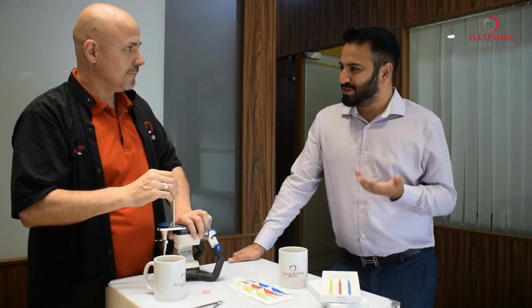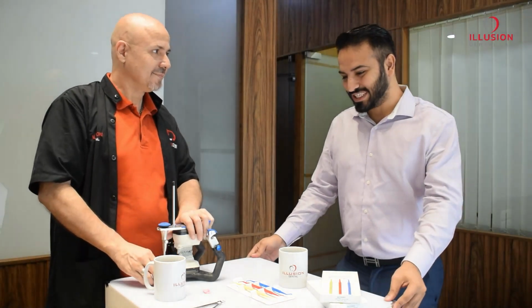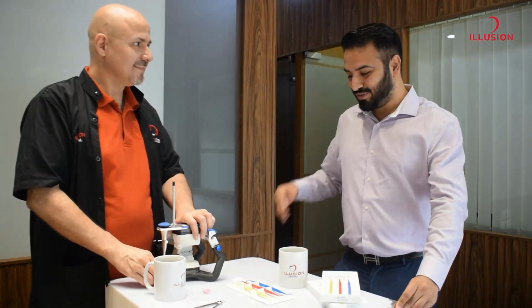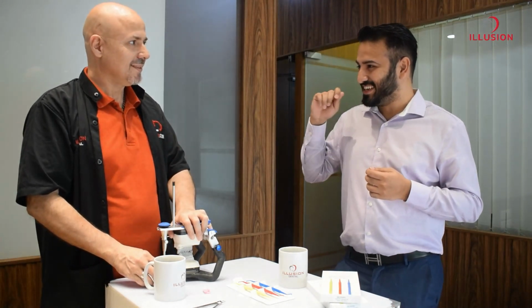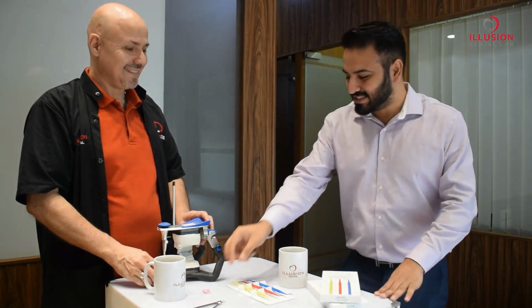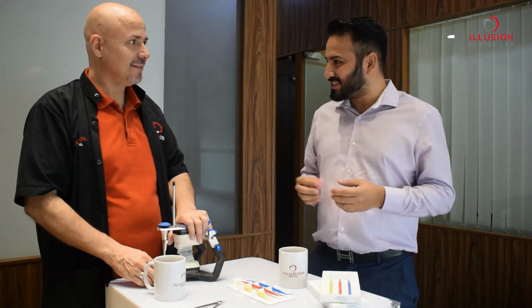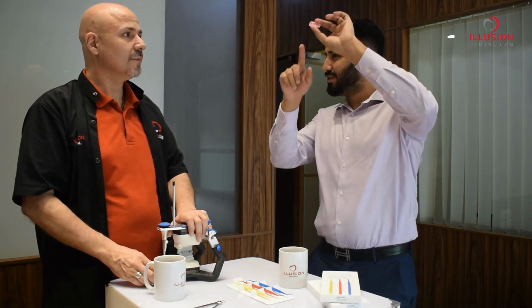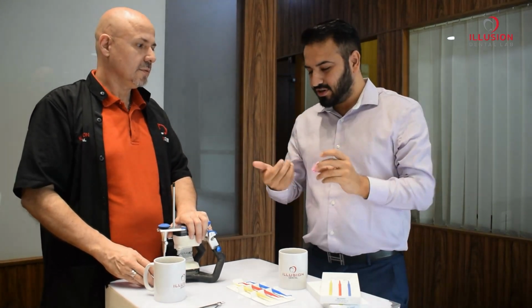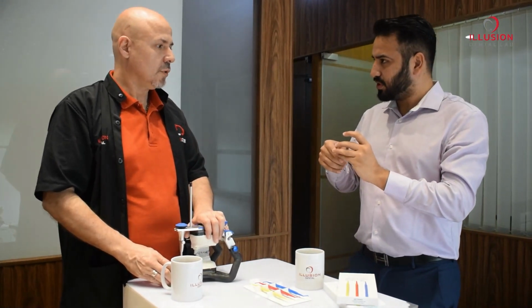It's such a simple trick, but I never really got to it, because in all my experience working in Europe for the export division, I always came across tips and tricks about a fleximeter and an occlusion clearance gauge. But it's a simple trick everybody could use: just have a bite record before the impression. Yes, and that's the trick. You get an exact view of where the clearance could be off, measure it, and then how would it go for zirconia, 0.8, 0.9, 1 millimeter?